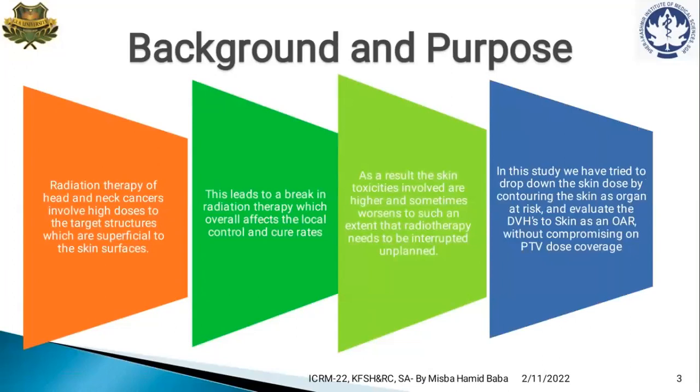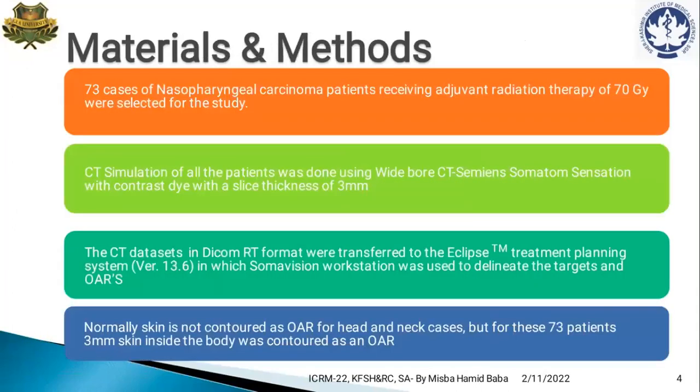Therefore, in this study, we have tried to drop down the skin dose by contouring the skin as an organ at risk and evaluate the dose volume histograms to skin without compromising on the planning target volume dose coverage.